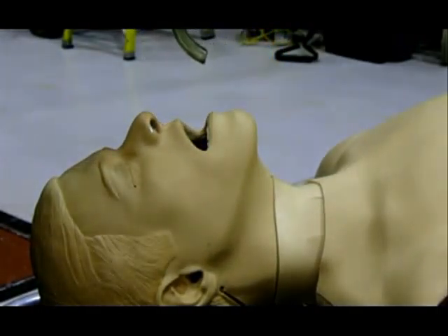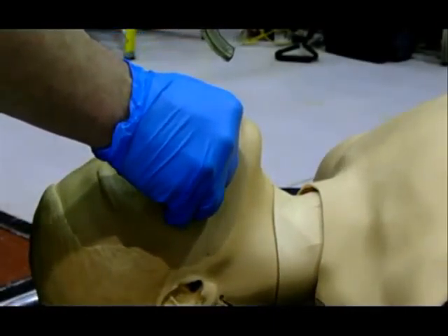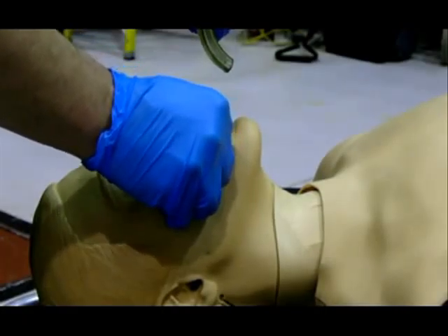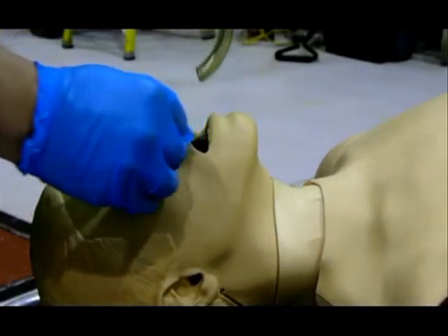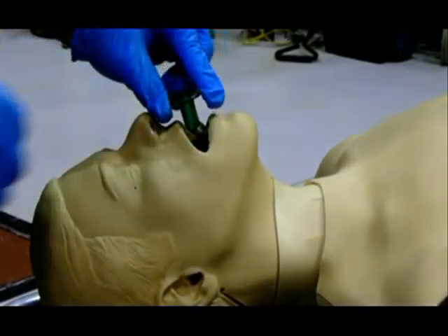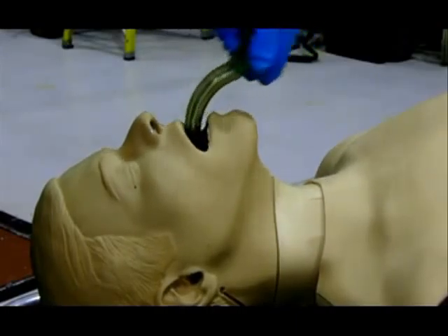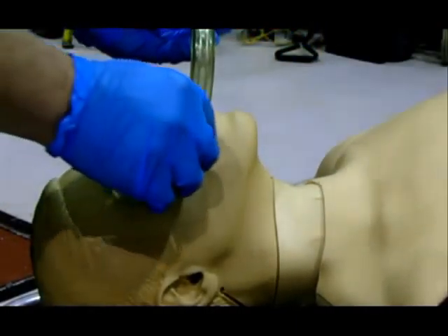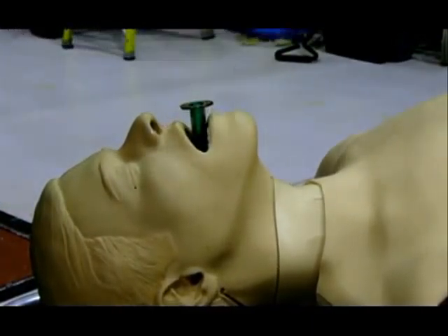Placement of the OPA. First, open the patient's mouth manually. The OPA can be inserted one of three ways: upside down with the curve towards the tongue, at a 90 degree angle with the curve towards the tongue, or in its normal position. With the first two techniques, insert the OPA until it reaches the back of the tongue, and rotate either 90 or 180 degrees to place the OPA in its normal position.